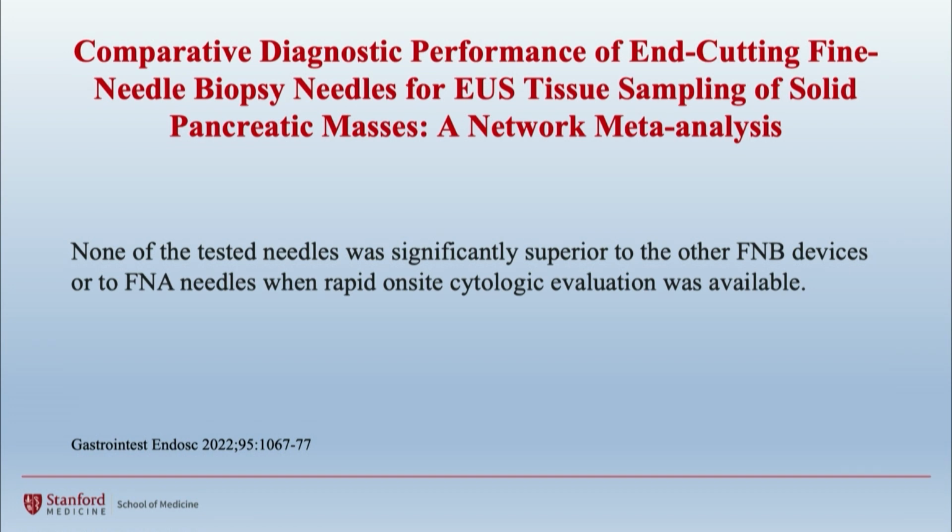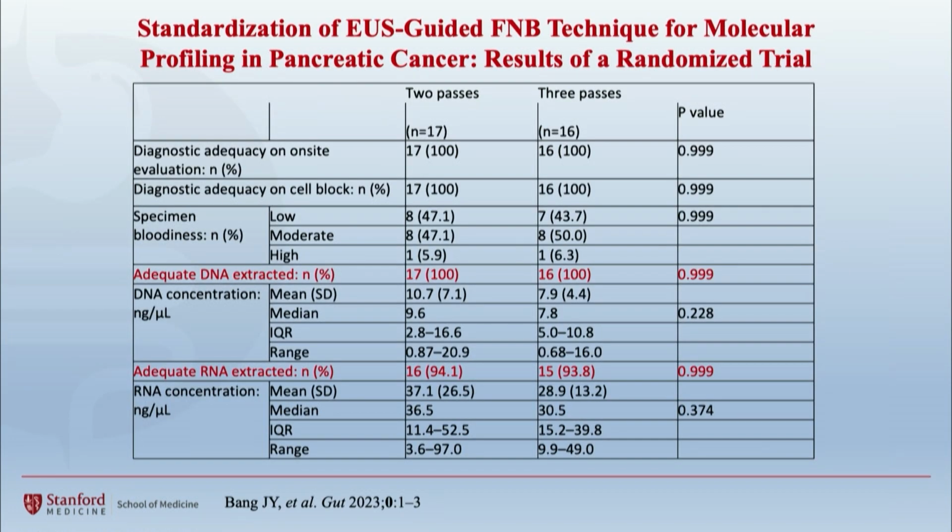This is a recent study looking at the biopsy needles when you're trying to give the oncologist genetic and/or molecular profiling that's been used for precision medicine in order to guide chemotherapy. It's been shown in this study that you can get an adequate sample for these studies, to guide chemotherapy, by just doing 2 passes with the biopsy needle and no need to do more than that.